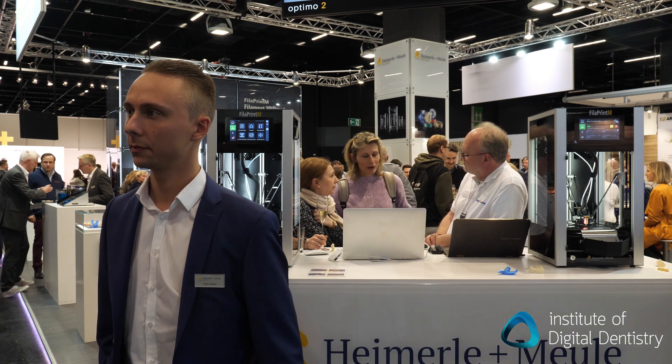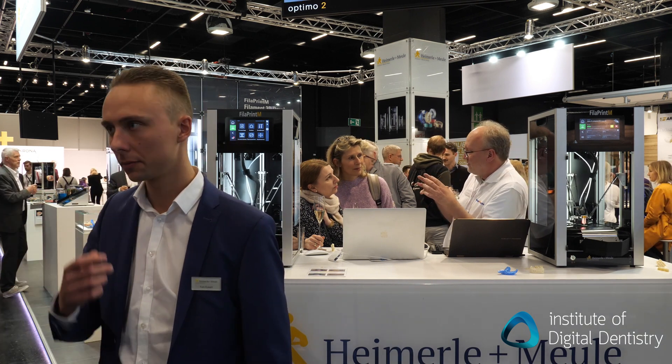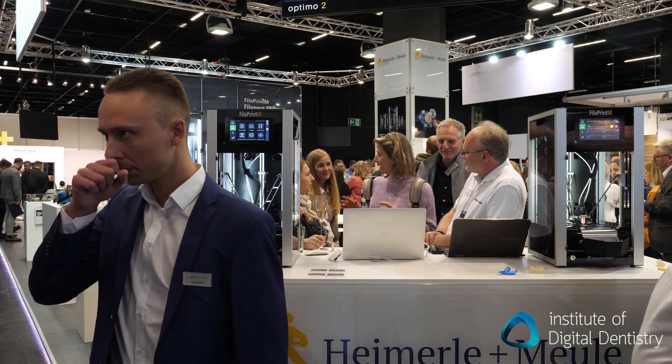Is there anything special about the filaments in terms of the materials they're made from? This is recyclable material that we have for the trays and the casts, for example. So what's the recycling process after they've been used? You cut it into pieces and then you can recycle it. So it's biodegradable. Are all of your filaments biodegradable? Only the materials for trays and casts. For partial dentures, the other polymers, this is not biodegradable.